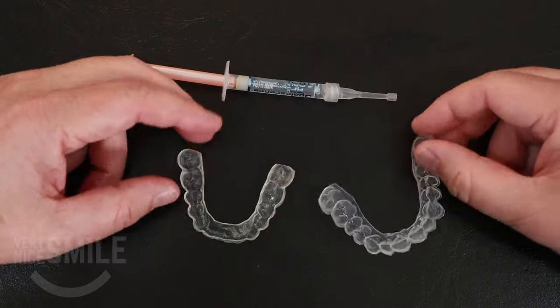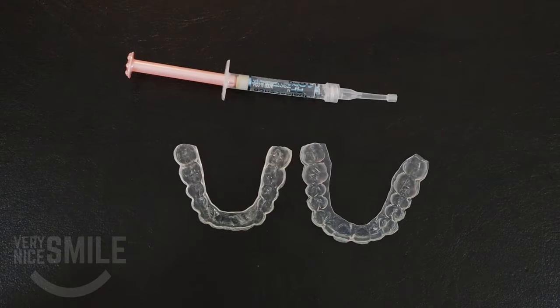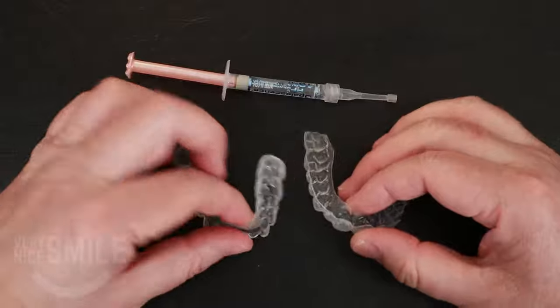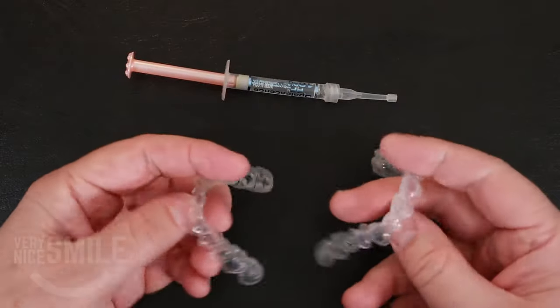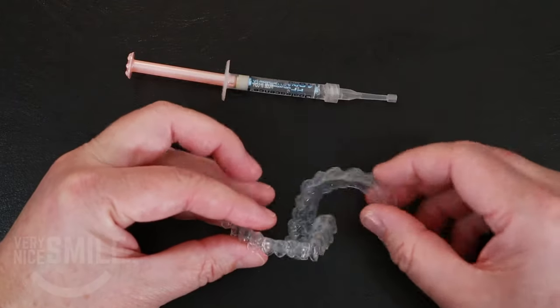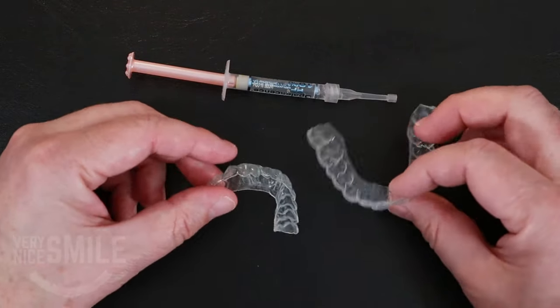First, I like to tell people: hold the trays so that they look like a U. You can see the U shape, and to tell the difference between upper and lower — upper has the two large front teeth, lowers have little front teeth, so that's easy to tell from that.